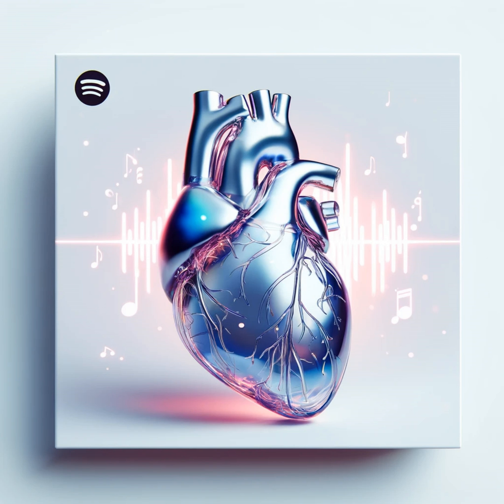As you diurese somebody with diastolic dysfunction, the small e prime should remain fixed, but the big E will improve, meaning it will come down. Therefore, the big E to small e prime will also improve. It will come down as well. The TR velocity will also come down.